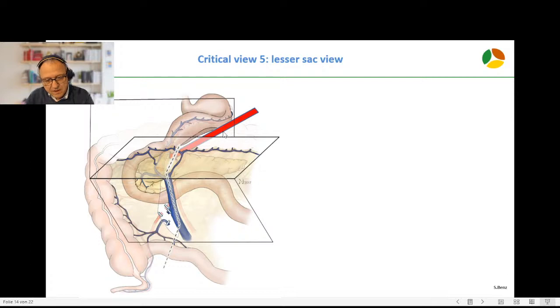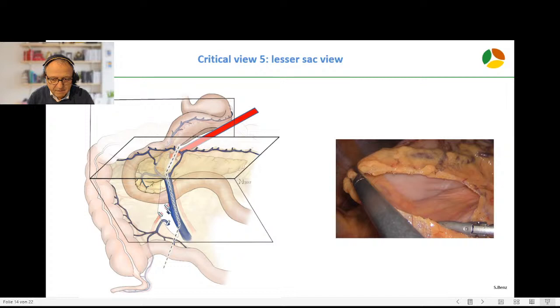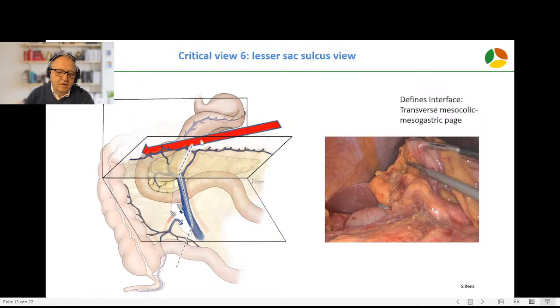Following the rule that you have to open the book before you tackle the vessels, we now first have to open the book between the stomach and mesocolon. We go through the gastrocolic ligament, look for the dorsal aspect of the stomach, which is critical view number five. Then we further open the gastrocolic ligament in a medial to lateral fashion, heading for the hepatic flexure, and divide the hepatic colic ligament. We reach the lesser sac sulcus view. These are the vessels in between: the right gastroepiploic vein, the Henle trunk, superior right colic vein, and the right colic vein.